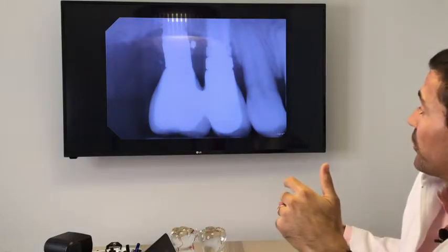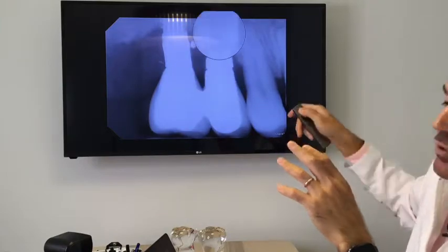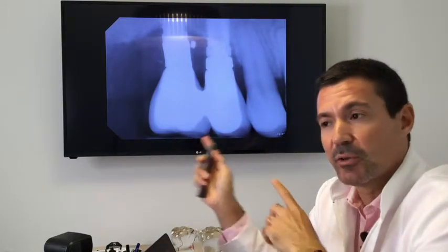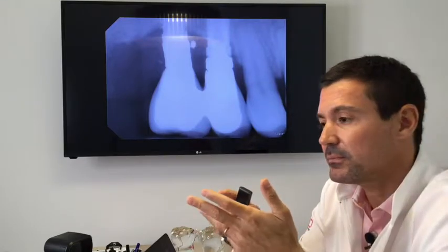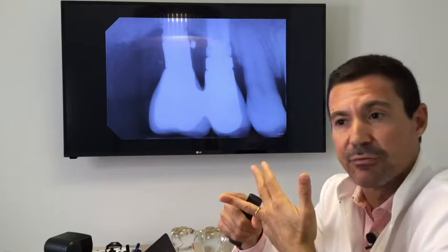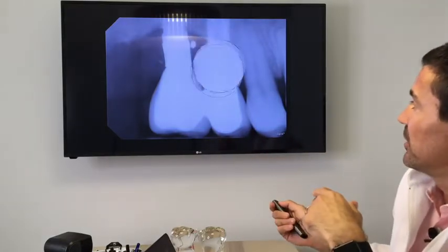And I tell the patient, we're going to find the screw, and we're going to try to re-screw that screw that is going to fit your abutment into the implant. But we are experiencing here a screw loosening. Potential factors: parafunctional habits, non-occlusal control, excessive activity of that area because of the absence or the lack of dentition on the other side, on the contralateral side. But at this point, I tell the patient, maybe there was a misfit here as well.